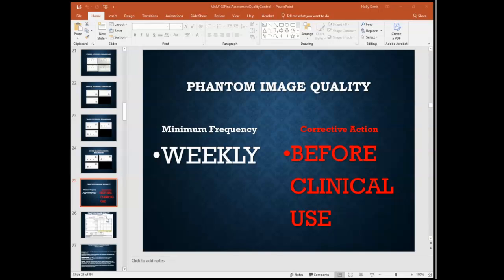All right. So again, make sure that you know the purpose of your test, why we're doing it, the frequency, how often we're doing it, the materials that you use, which in this case is your phantom and the large paddle, and then your step-by-step procedure, which is, line your phantom up at the chest wall border of your detector, compress to 4.2 centimeters, which is usually about 12 pounds, which we'll talk about when we do the compression thickness and all that. But anyways, just know your step-by-step procedure.